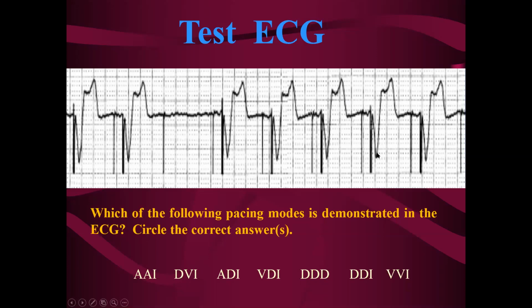Now, is there any misbehavior from the pacemaker here? It double senses, coming before the P wave and following the P wave. So double senses, and in between also the pacemaker is sensing. You suspect oversensing? Oversensing, yes, it is oversensing. Okay, good.